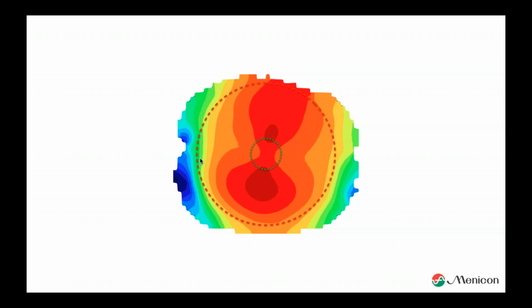A topographer provides us with more information of the periphery of the eye. Well, use that information, so start from the outside and work your way back to the inside, so that we actually start with the fit, the actual fit. So that's why it is important that we really start learning about corneal topography.